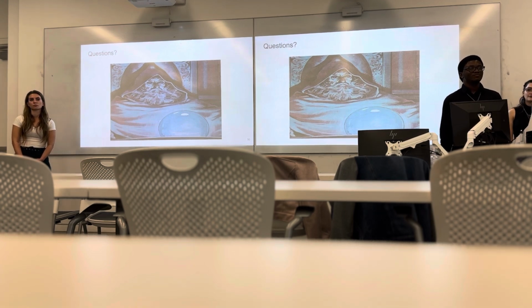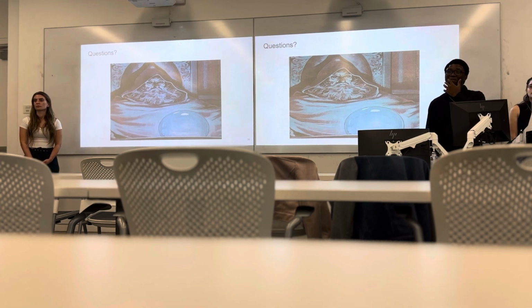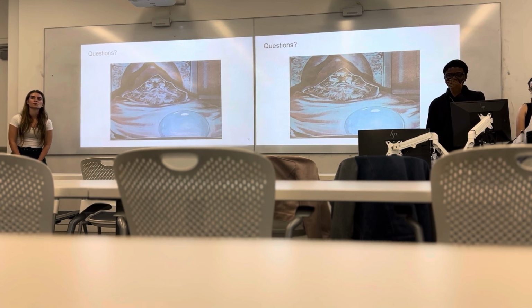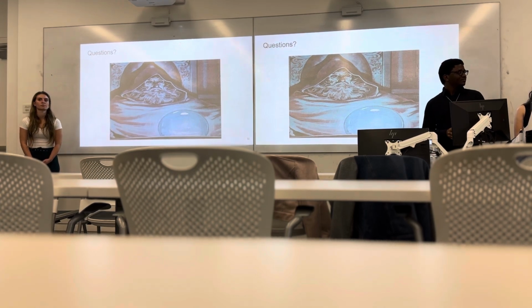Thank you. Do one more student question and comment. I noticed this blue line going along the curve of the tube. What's that for? That is for x-ray machines to be able to see where the endotracheal tube is inside of the patient. Okay.